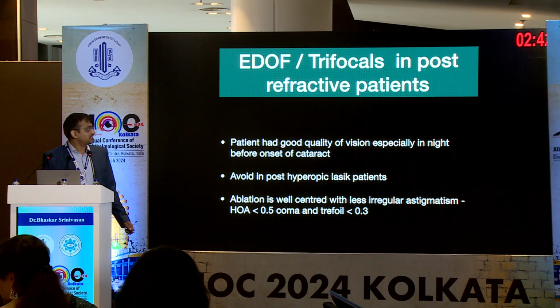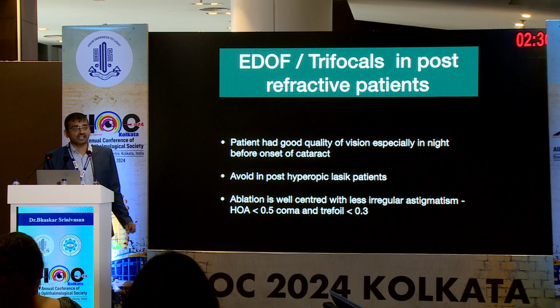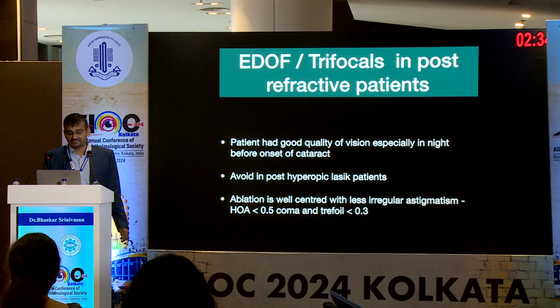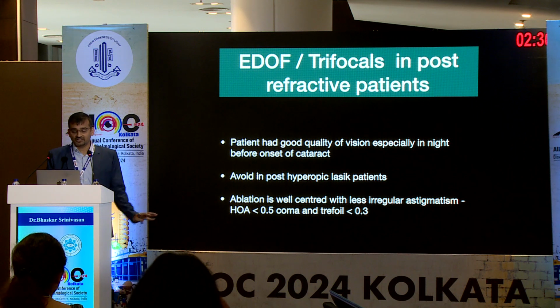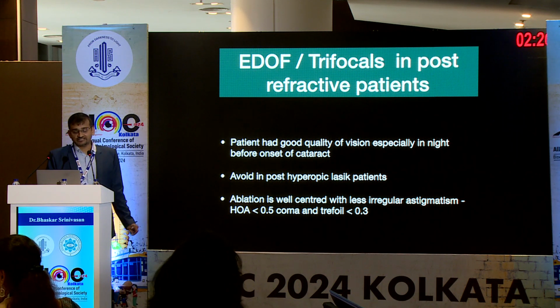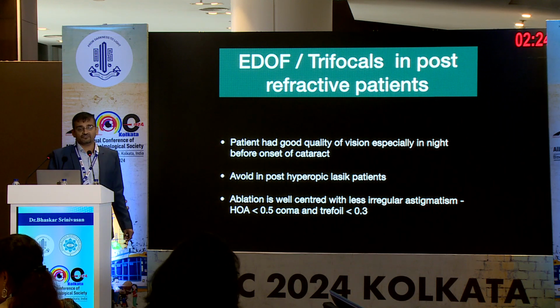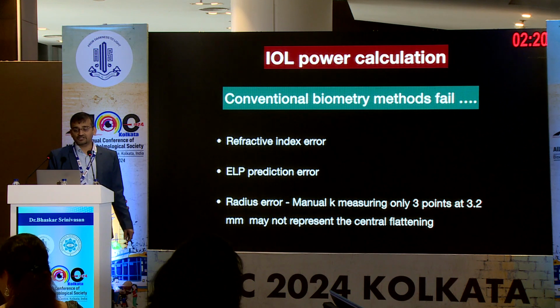EDOFs and trifocals in post-refractive surgery: we have to ensure that the patient had good quality of vision, especially at night, before the onset of cataract, if you're considering these lenses. Post-hyperopic LASIKs should completely avoid these lenses. We have to check that the ablation is central, higher order aberration is below 0.5, and any coma or trefoil in absolute value should be below 0.3.